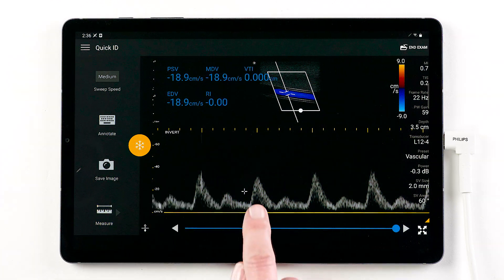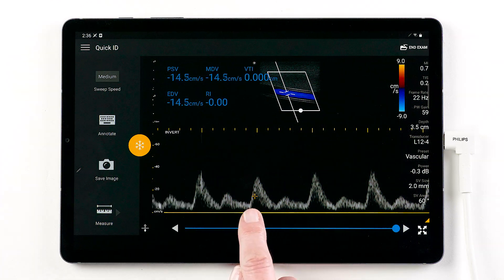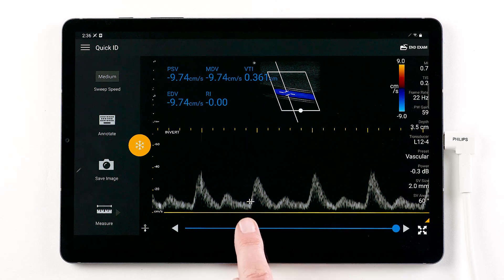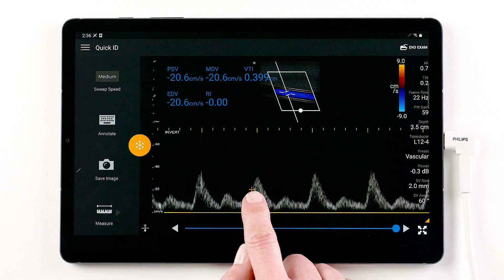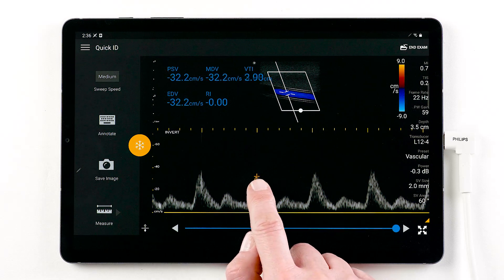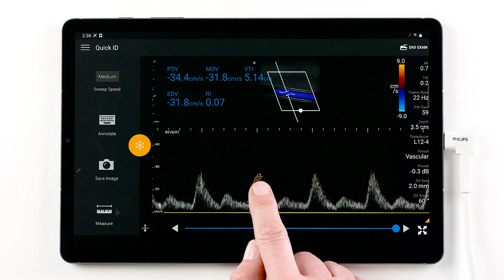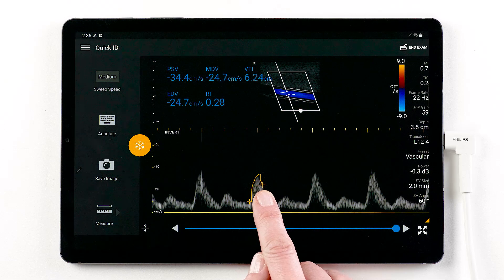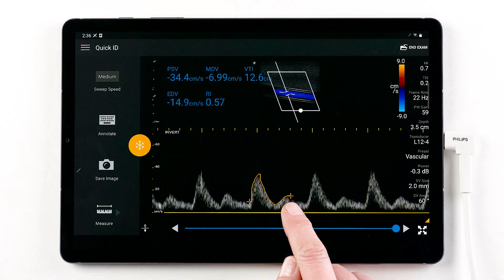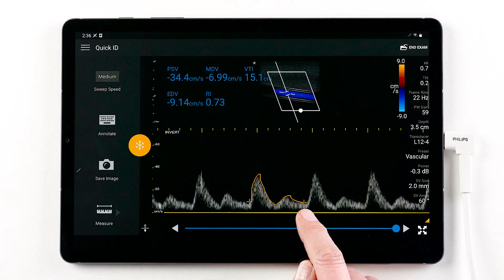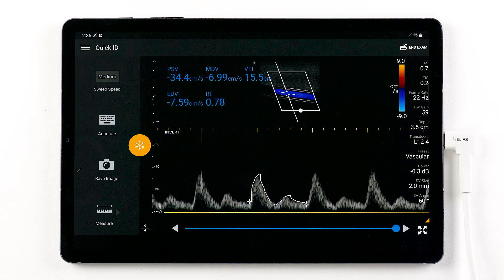Trace measurement where you need to drag the caliper to the start of the waveform and lift your finger to launch the trace tool and begin the trace. Measurement results are customized to the selected preset.